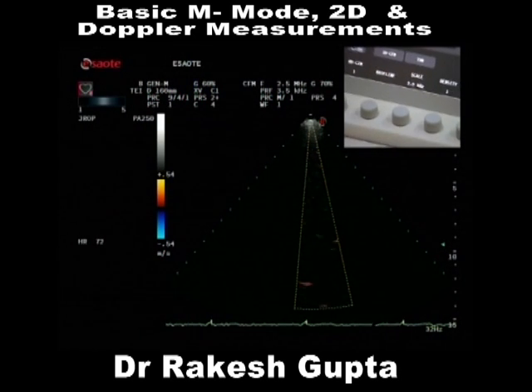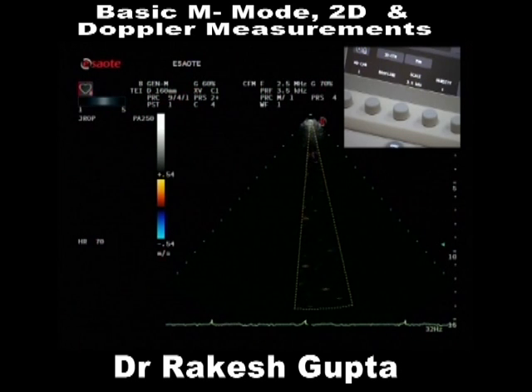Any question by now? Go ahead, ask me instead of asking him. 50 to 60. Not color gain, Nyquist limit reduced to 30. Why is it reduced? Because pulmonic venous flow is around 30 centimeters per second.